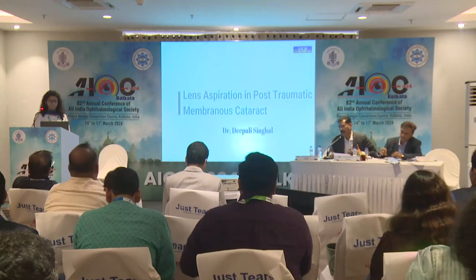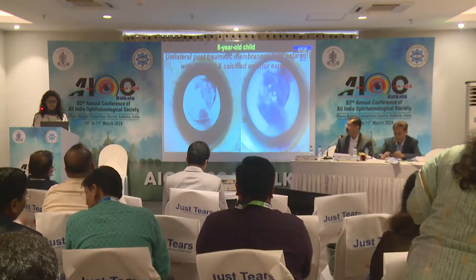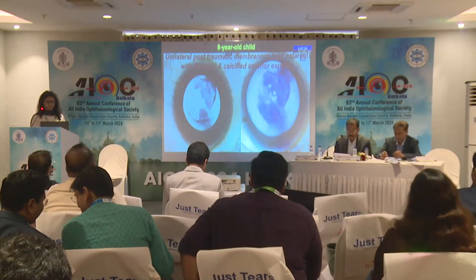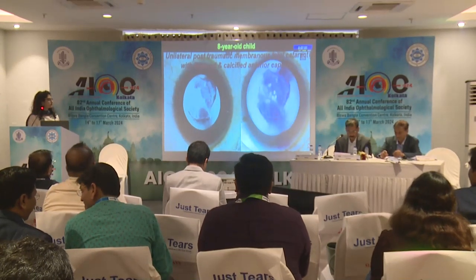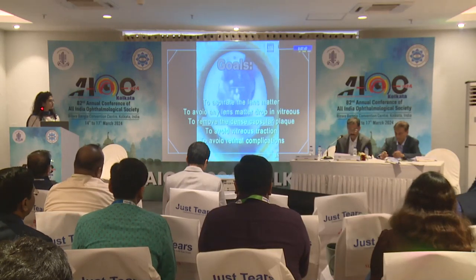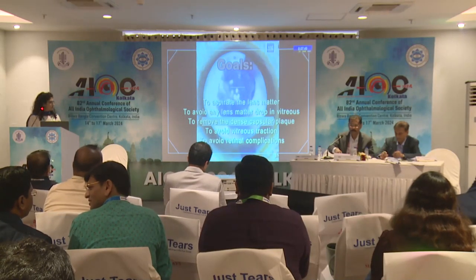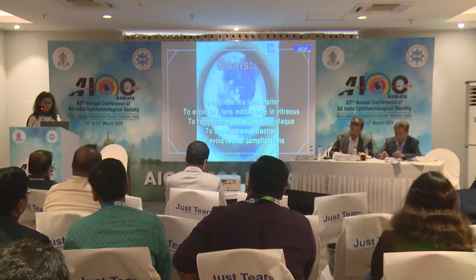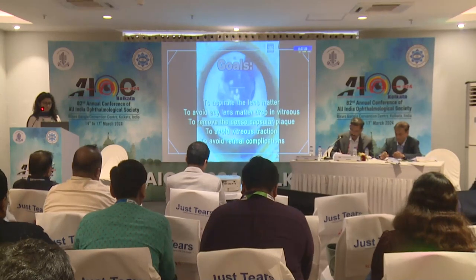This is an 8-year-old child with post-traumatic total membranous cataract with a fibrosed and calcified anterior capsule. So I planned for lens aspiration with PCIOL implantation. The goals here are to aspirate the lens matter without any drop into the vitreous, to remove the dense capsular plaque, and to avoid any vitreous traction or retinal complications.